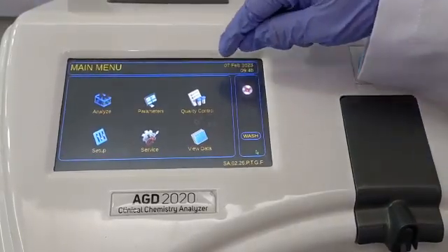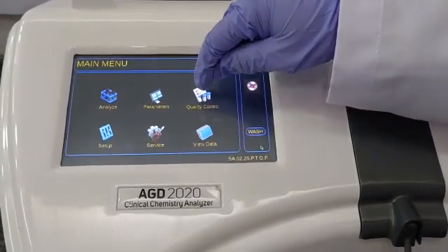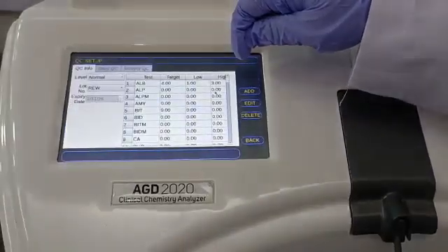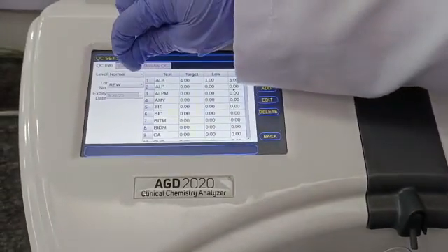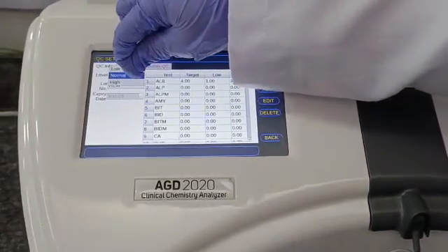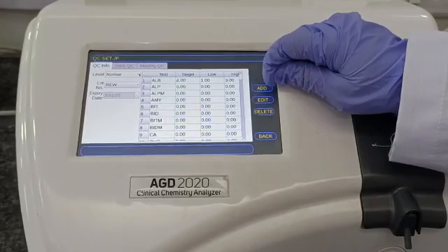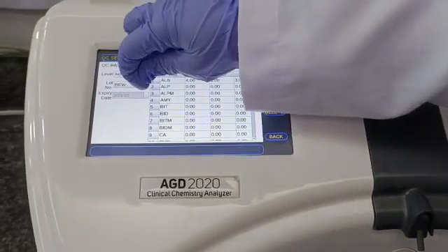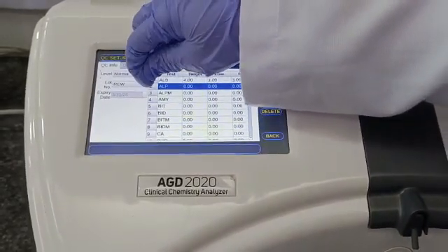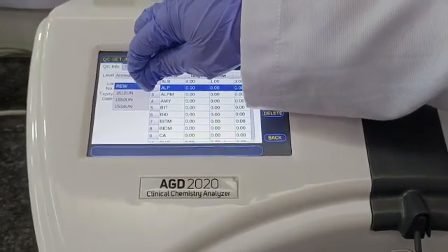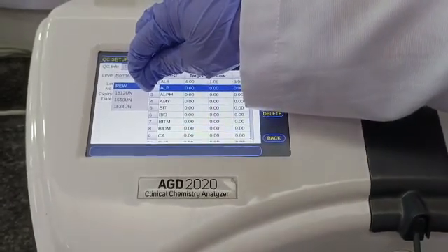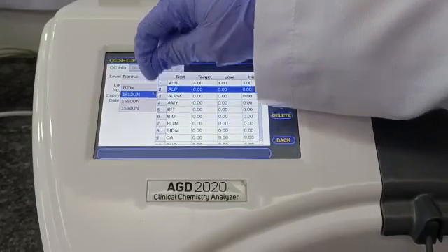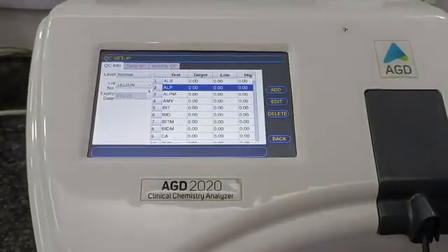We will see how to perform a quality control for glucose. First, we will select the level for glucose. We generally use Randox controls for our QC checks. The Randox control has two levels, mainly the normal and the high.